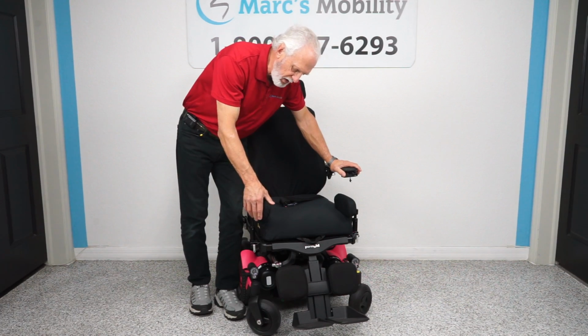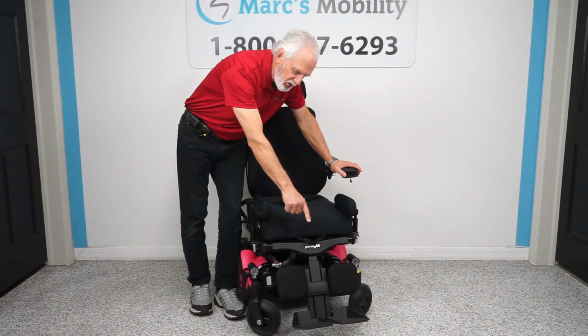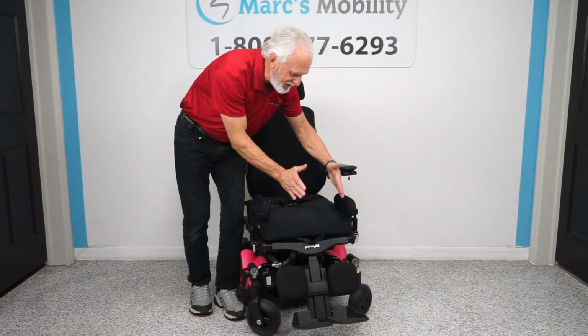These are really nice. They're about this thick in cushion. What these do, they keep your feet on the foot plate. They keep your knees together.